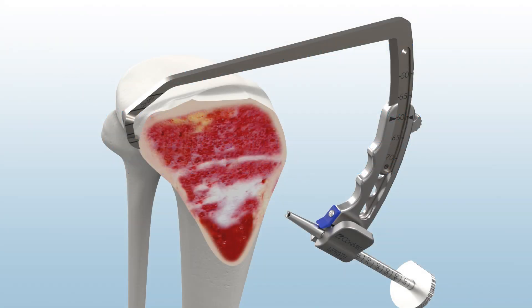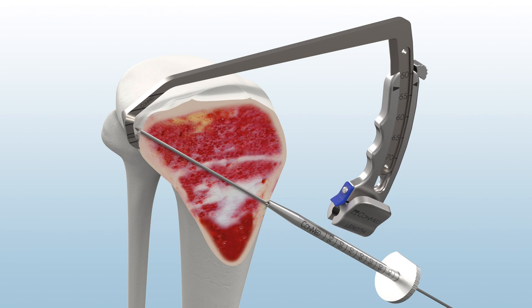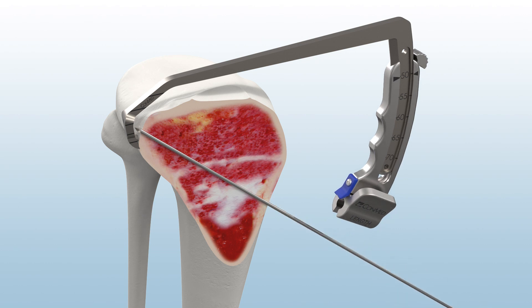Under direct visualization, advance the 2.4 mm guide pin through the anteromedial tibia until the pin contacts the pin capture point. Then, remove the guide sleeve but maintain the position of the guide arm and body to protect vascular structures while reaming.